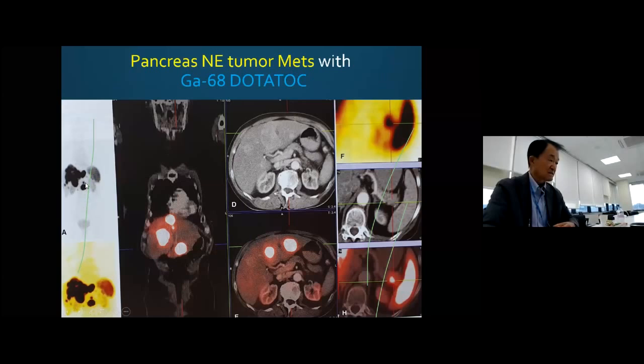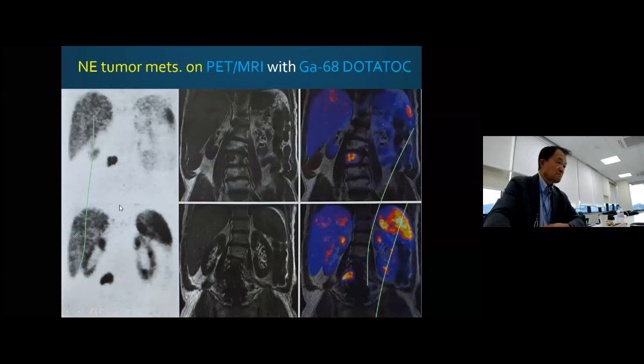And you can see very intense, multiple lesions filling all the liver here. This is DOTATOC, pancreatic tumor metastasized, very intense functionally. And another case is also here.